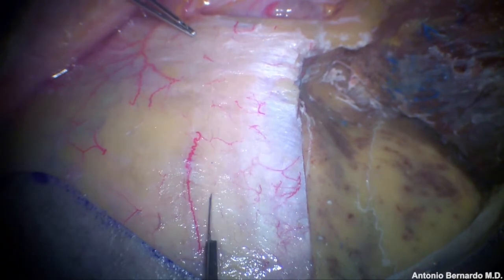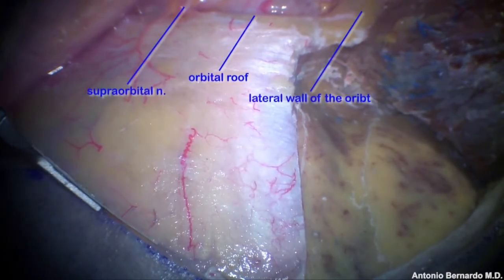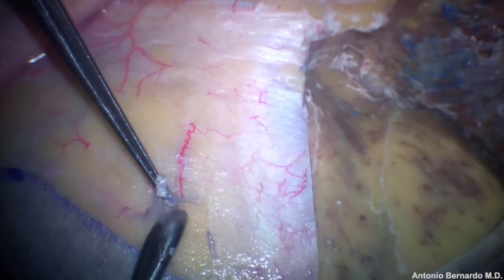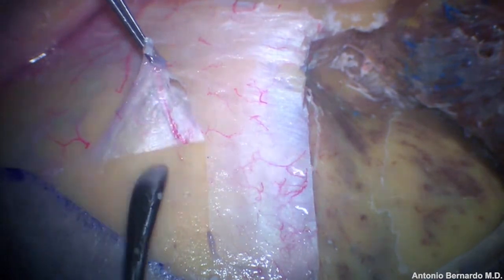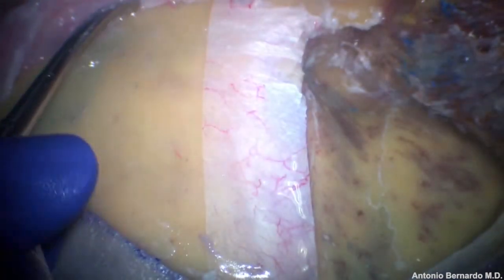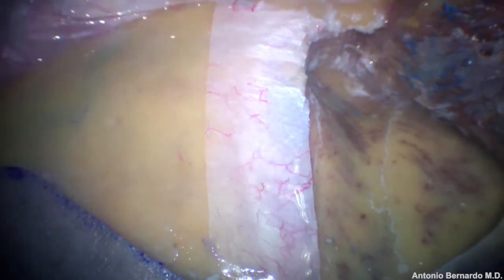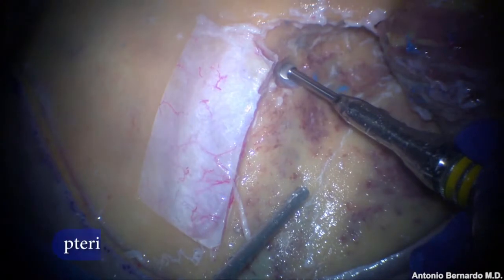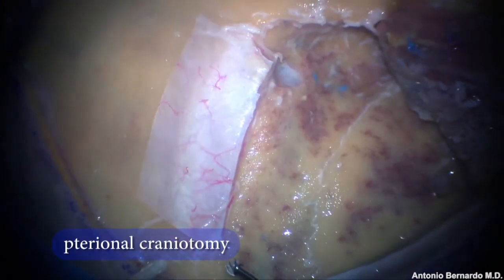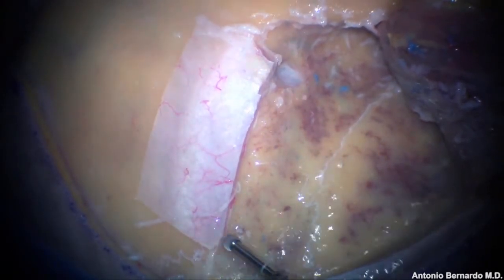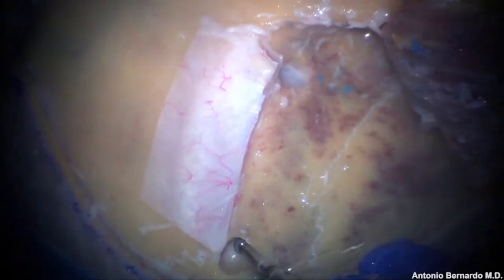The periosteum is incised and the periosteal flap is elevated anteriorly. The periosteal flap should be kept intact as it will be re-approximated at the end of the approach. The first step of the two-piece orbito-zygomatic approach is the pterional bone flap. A standard MacCarthy burr hole is placed just posterior to the frontozygomatic suture, and a second burr hole is placed posteriorly along the superior temporal line.